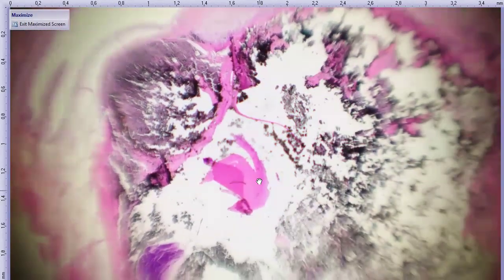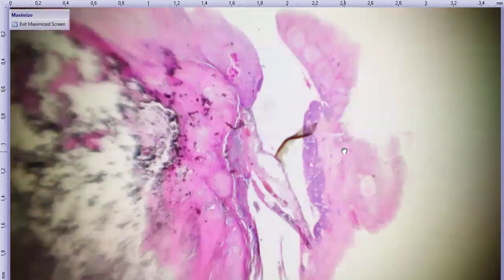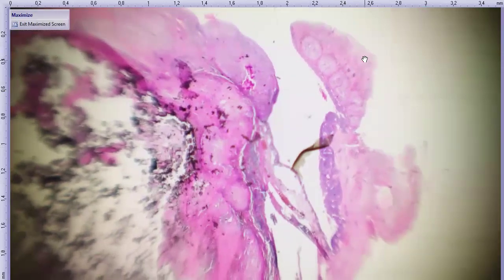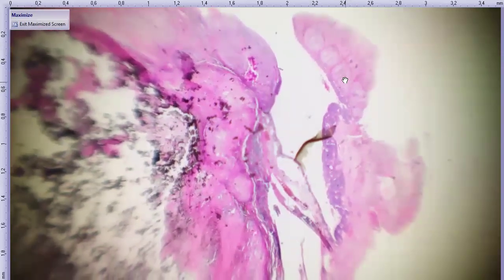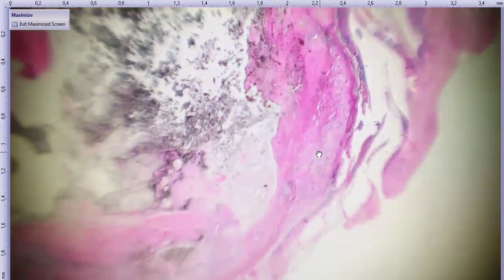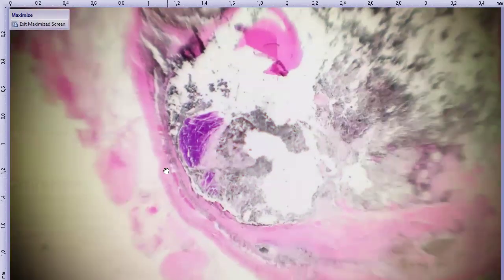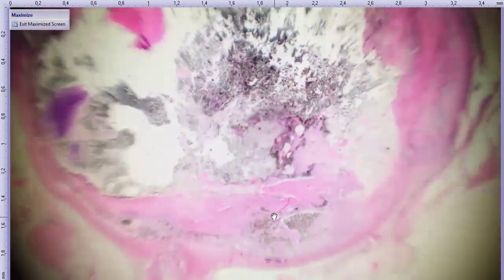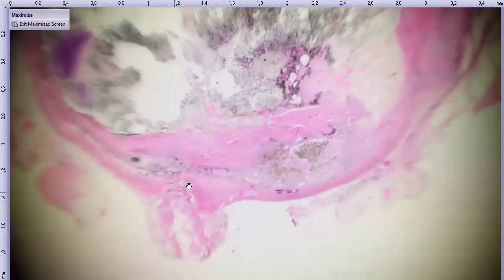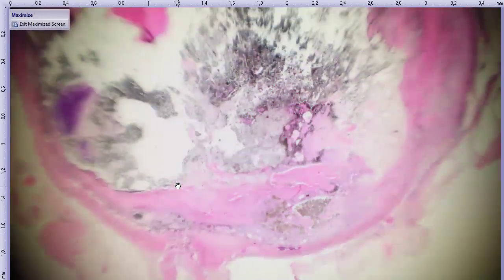A little bit of lens right there, maybe a little bit of lens capsule here. We follow the other side. Here's more eyelids. Beautiful row of meibomian glands right there. So this is kind of eyelid margin. Coming around, here's the sclera. And we go to the other side, some mineralization. We're starting to see maybe meninges, so we're close to the optic nerve right there.